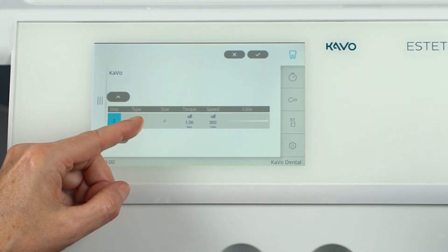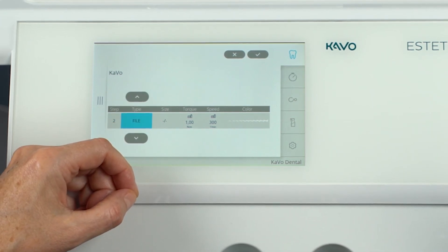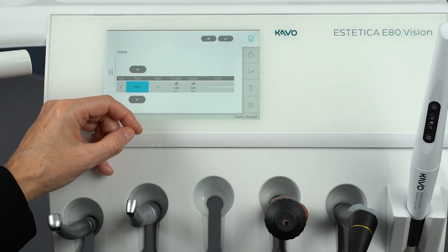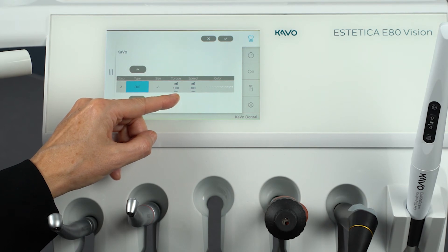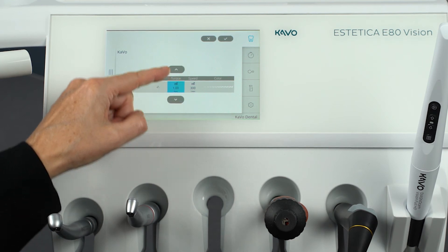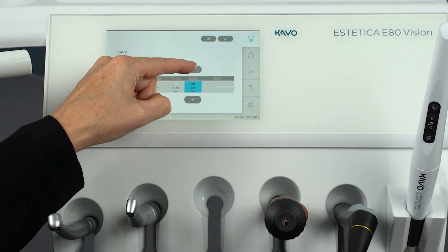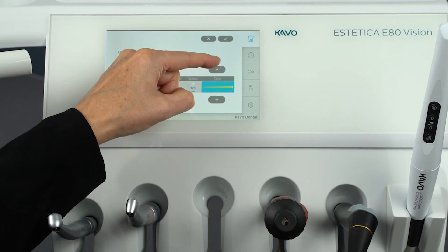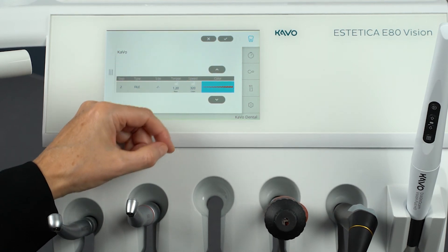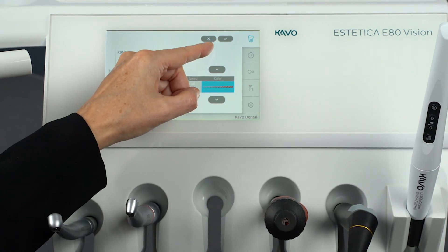To define user-defined files, tap the type column and use the arrow keys to select File. All other data must be set manually according to the file manufacturer's specification. Tap the respective column and use the arrow keys to select the desired data values for torque, speed, and color of the file. To save the set data and finish editing the file sequences, simply tap the Save button.